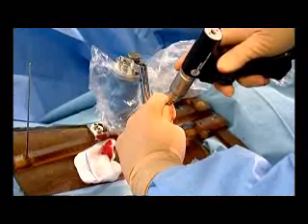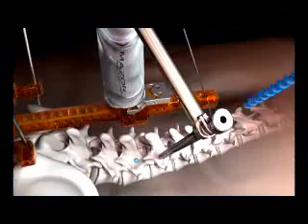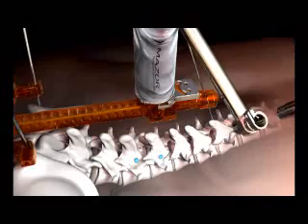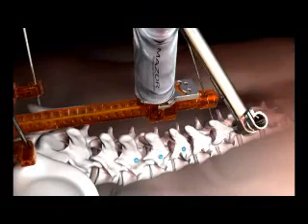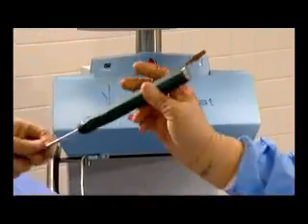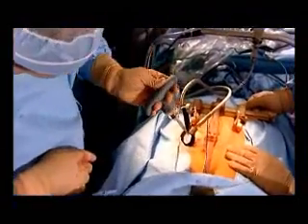The surgeon drills and prepares the pedicle with the help of the miniature robotic device and repeats the procedure according to his plan. He then places the screws, either cannulated or solid. With this process, minimally invasive surgery is conducted.